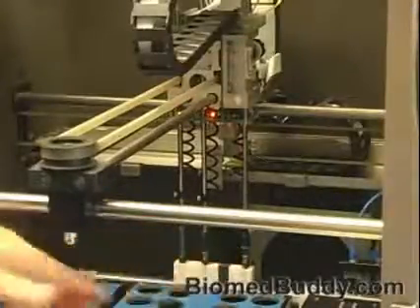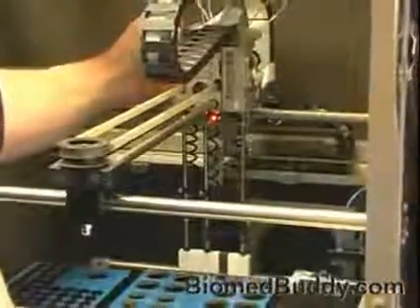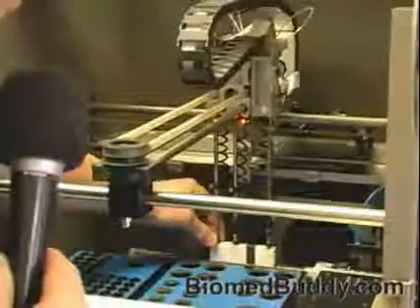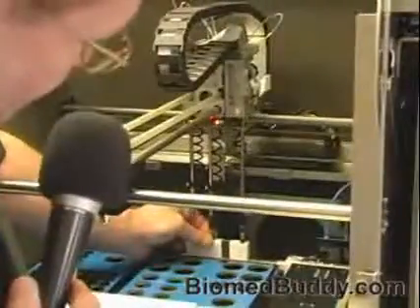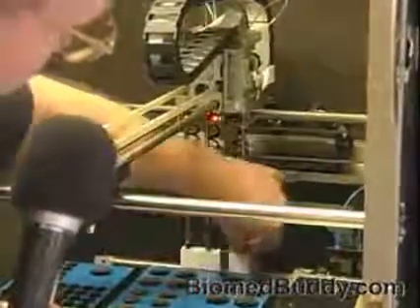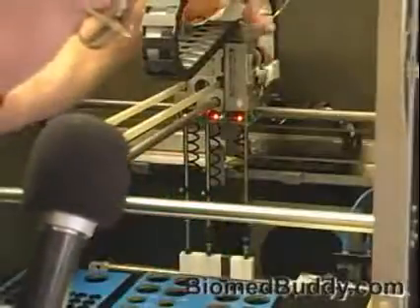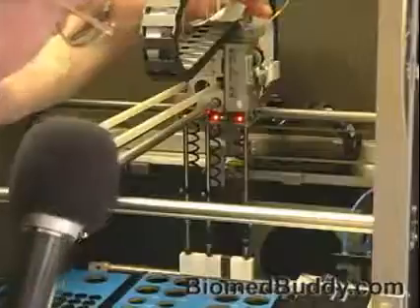Now you've heard me talk about BBs getting caught in the wash well, and I think this is the main reason you do this. They're all the way down, and I'm going to raise each one just a teeny little bit, like a BB distance. Just a little. This is what determines how low these needles go into the wash well. There's the bottom. Here's how high we're raising it.